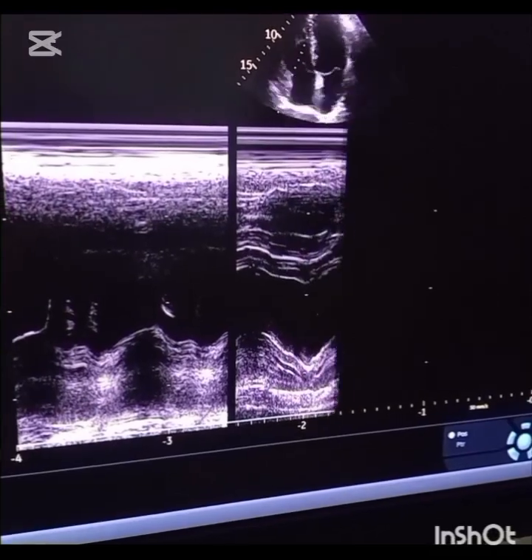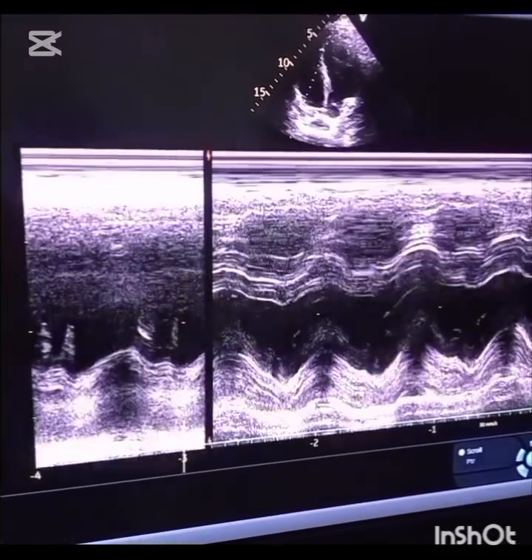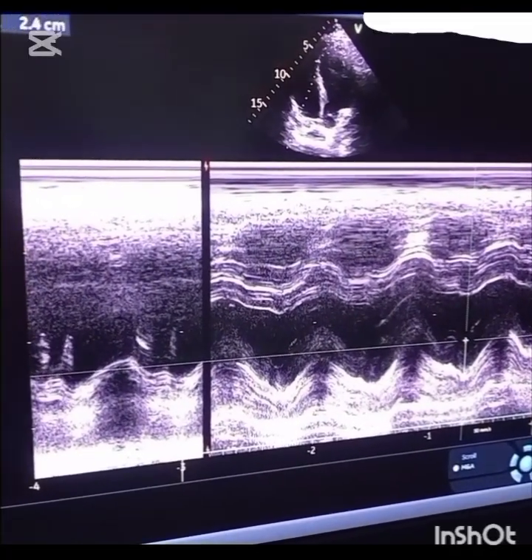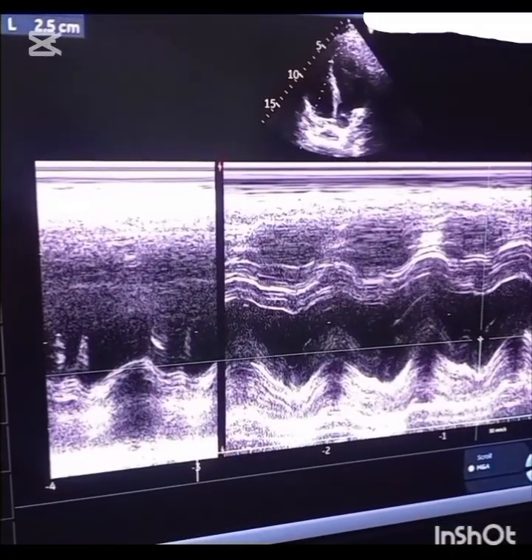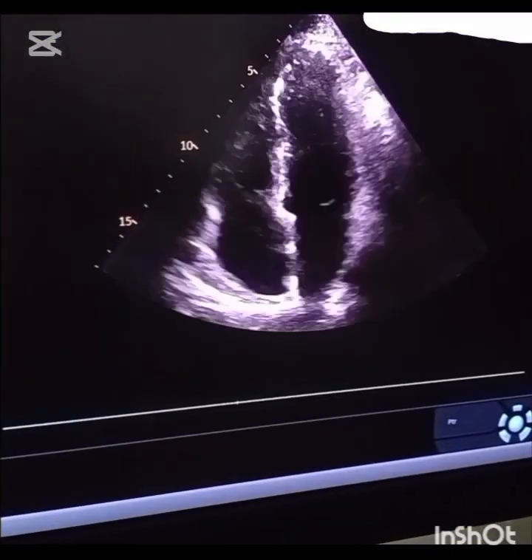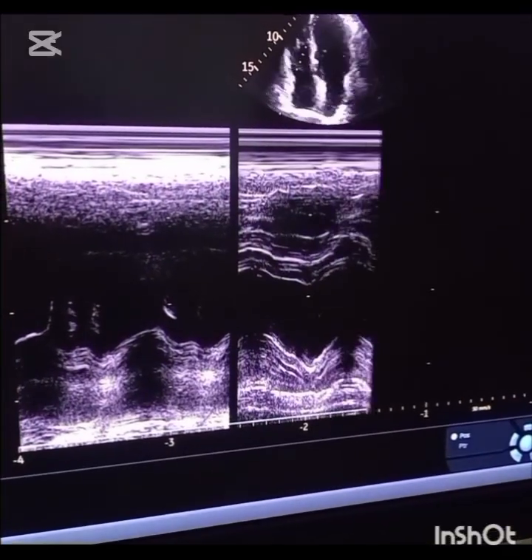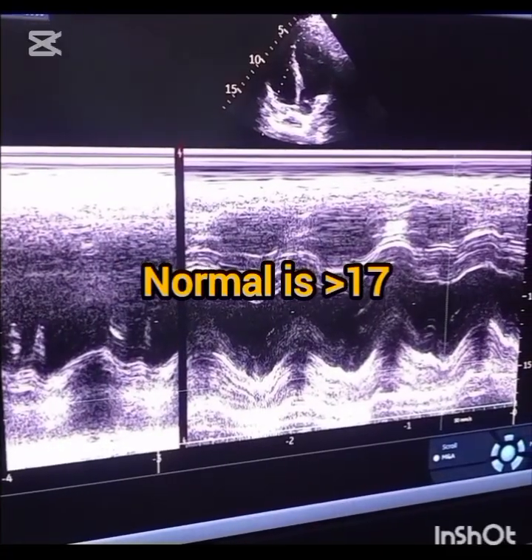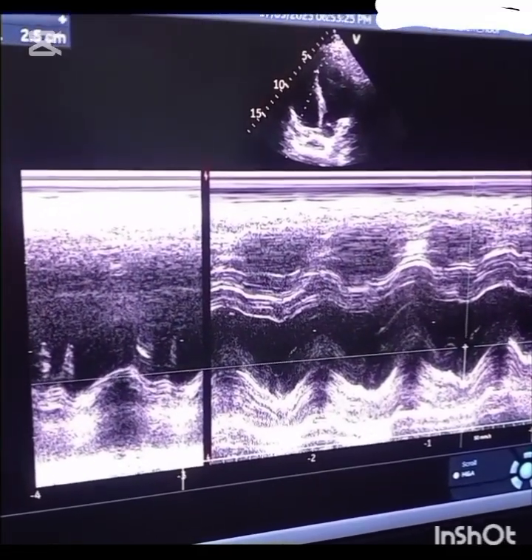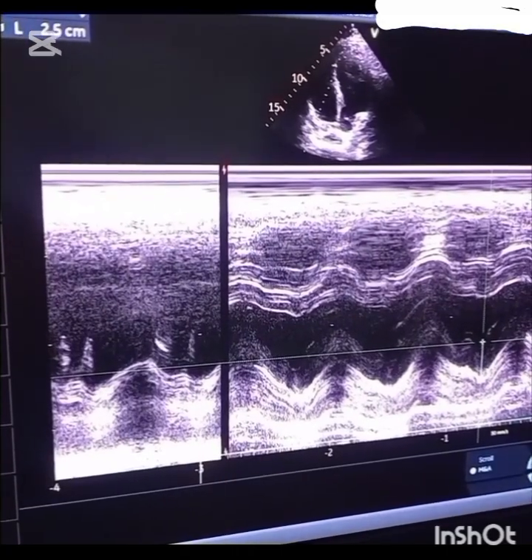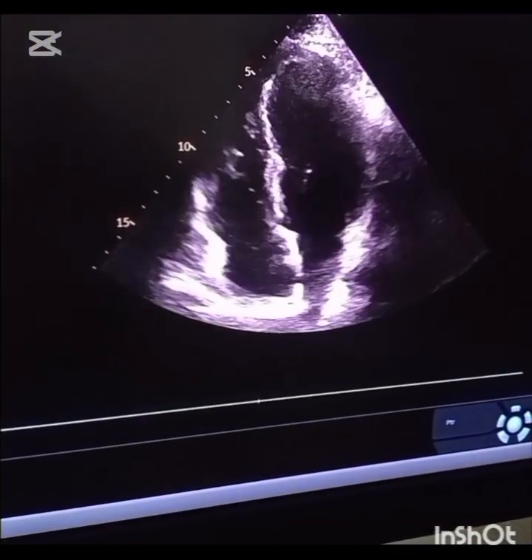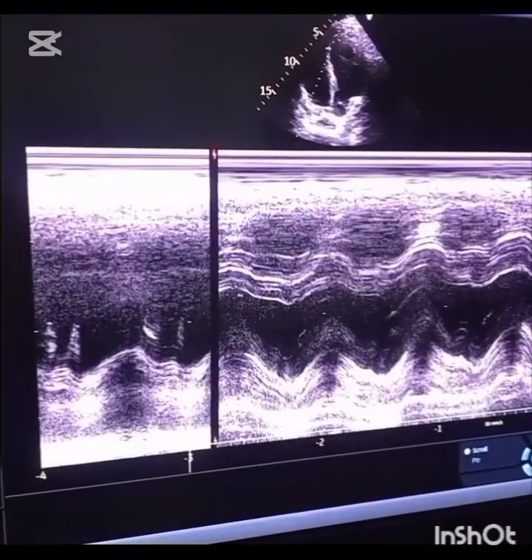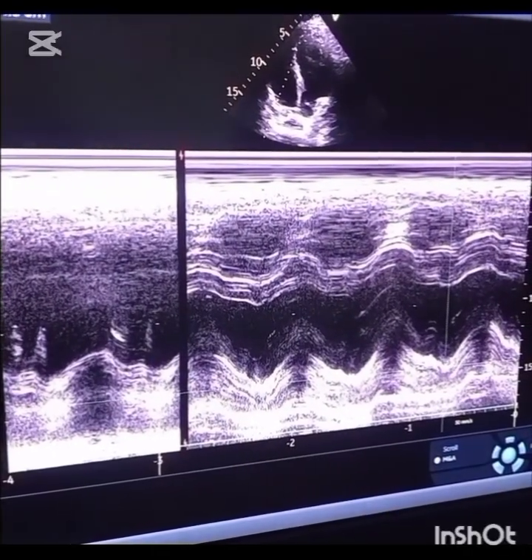We place the M-mode on the lateral annulus and measure the displacement of the annulus between end diastole and end systole. As seen in the video, the measured slope is 2.5 cm or 25 mm. Normal value of TAPSE is equal to or greater than 17 mm. Less than 17 mm indicates right ventricle systolic dysfunction. Limitation: it is angle dependent, must be well aligned with the motion of the annulus, and reflects only longitudinal contraction, not global right ventricle function.